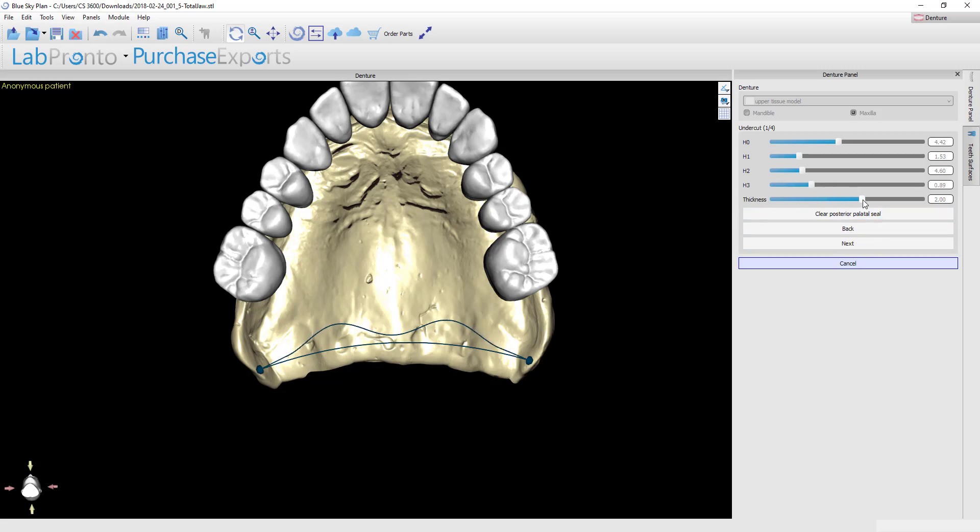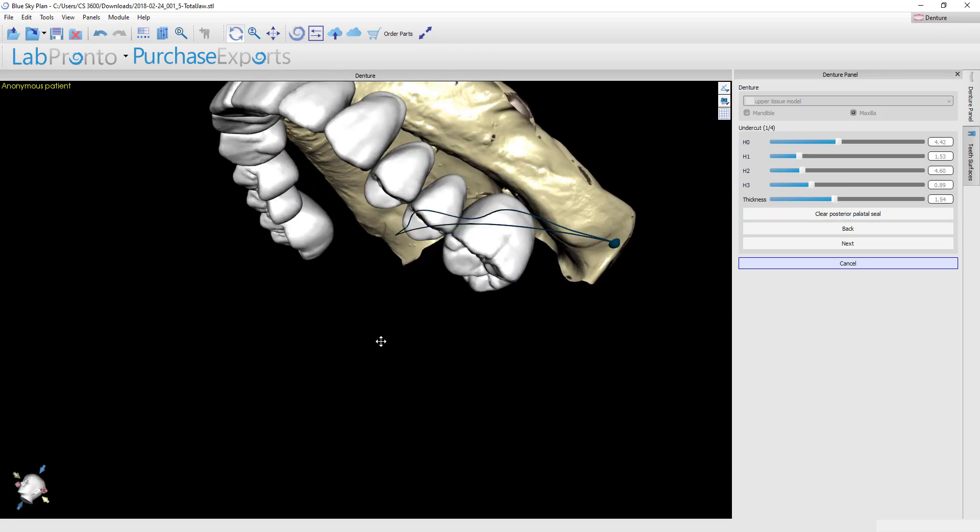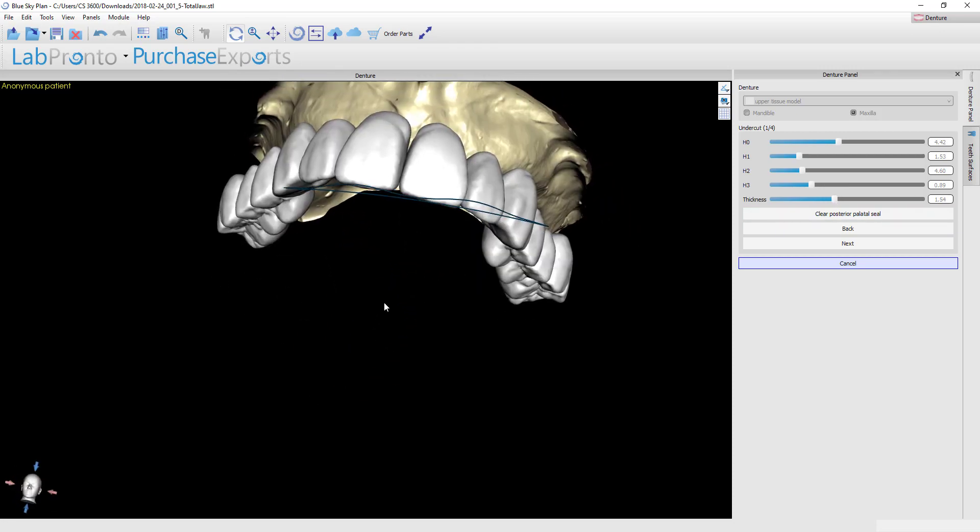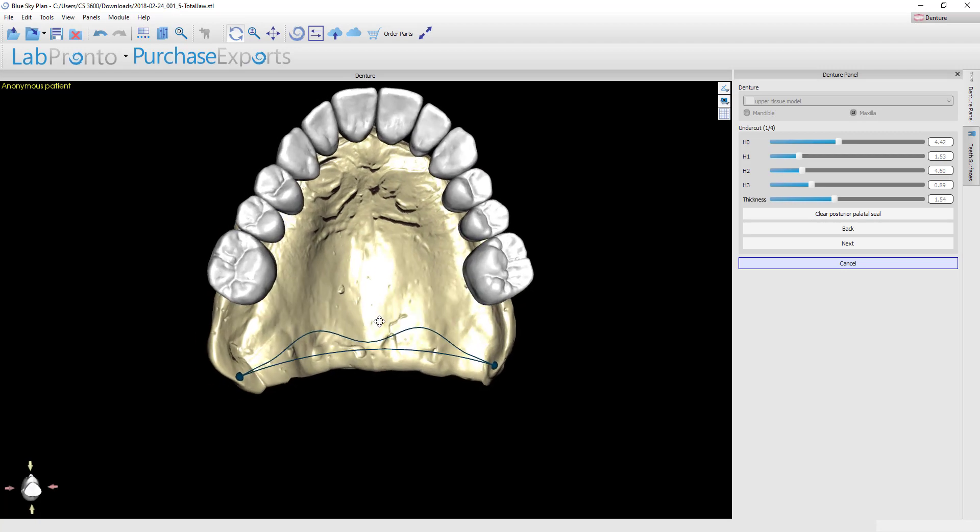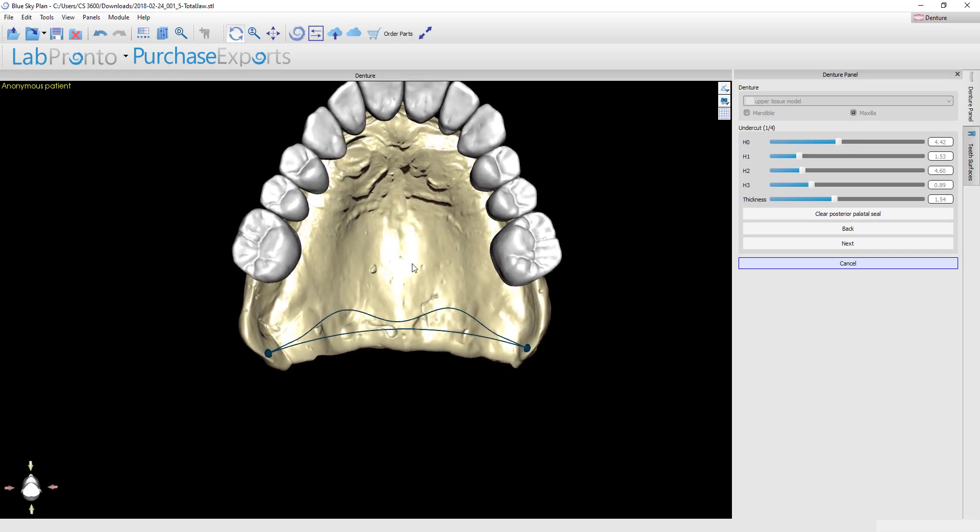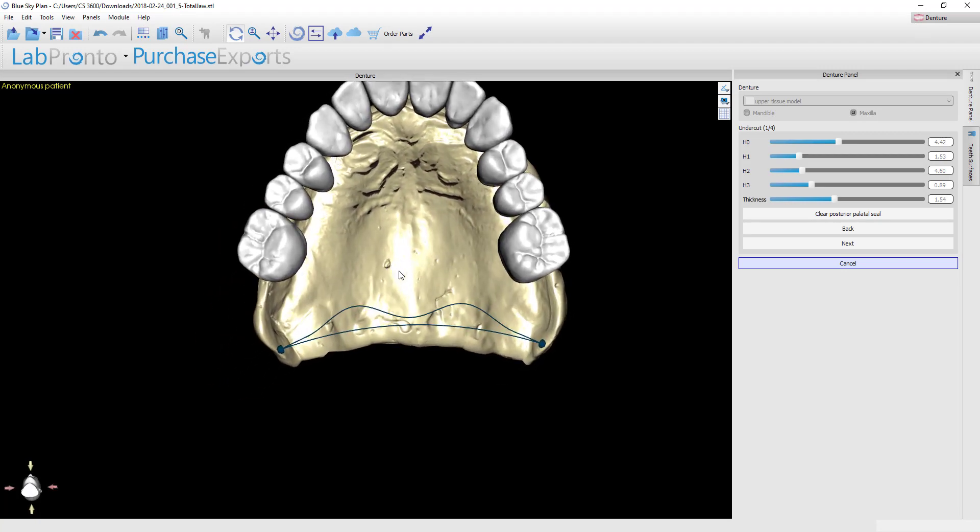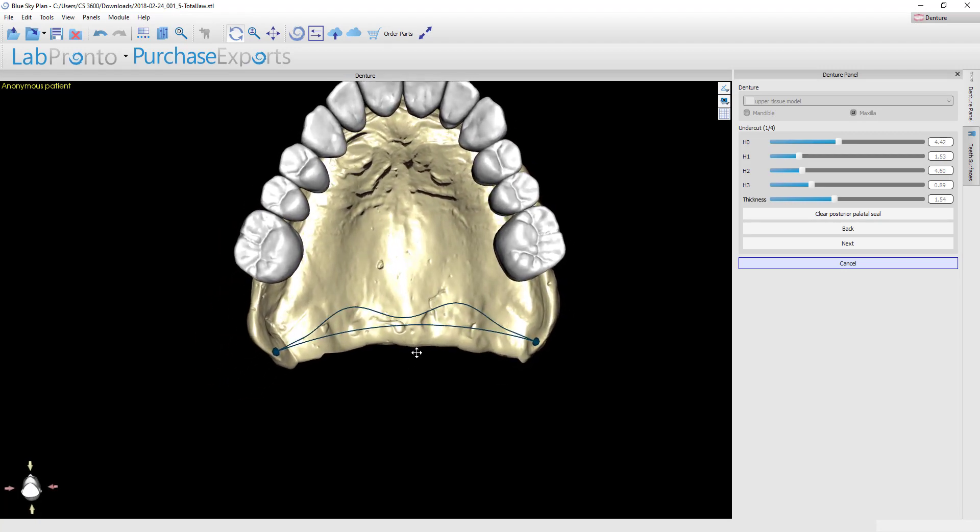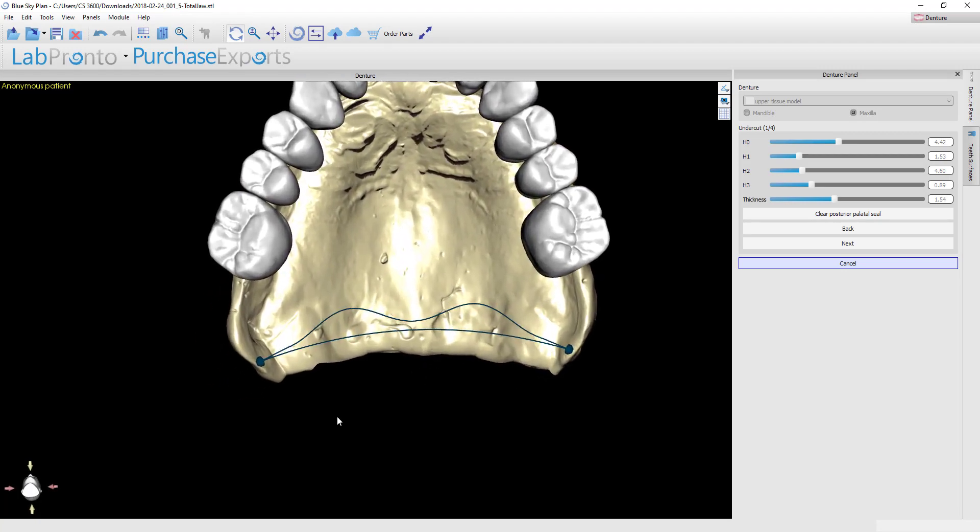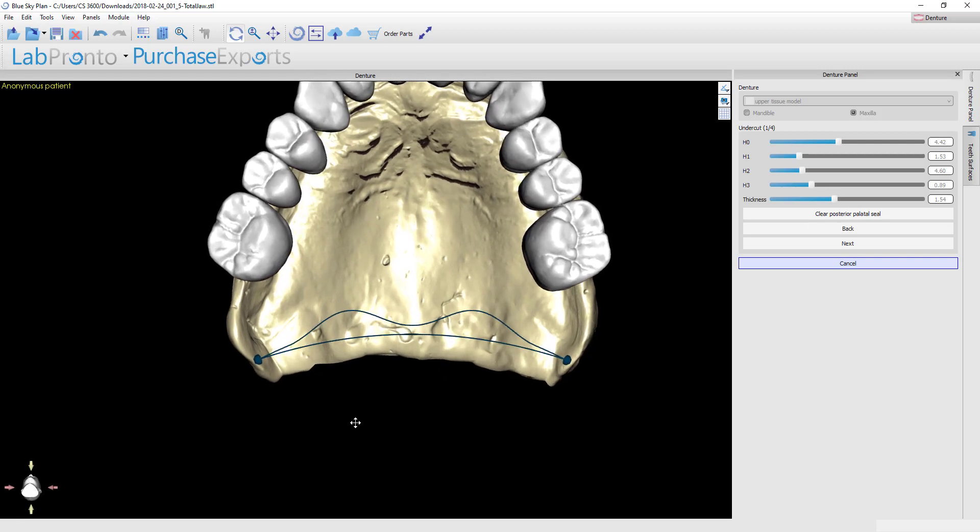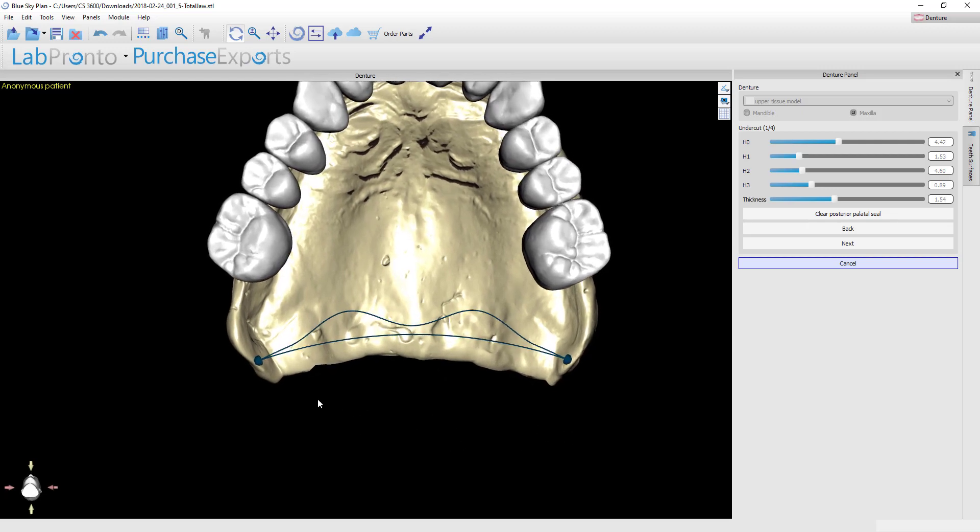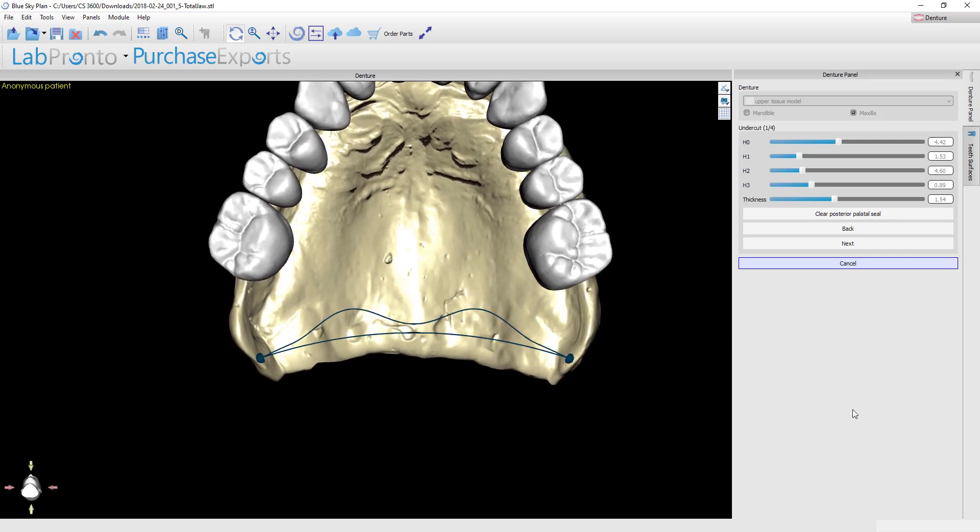I usually go with a posterior palatal seal that's about a millimeter and a half deep. It wouldn't hurt to go two millimeters—it's easy to reduce, it's not so easy to try and add if you don't do enough though. With that done, I want to look at this model from the occlusal view, make sure that I'm happy with the shape, and as soon as I am, I can go ahead and click Next.